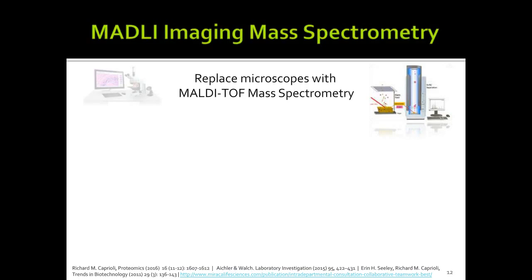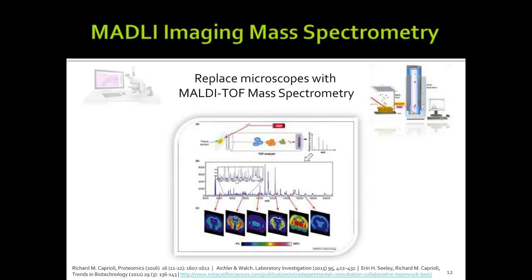This slide just shows a general workflow of imaging mass spec, to show the feasibility of it. People have been doing that, and we are working on it. I think this is a very feasible area for the future for us to give more thought to. On the top is the MALDI process. We have the ionization process, we have the TOF to separate ions, and then we get the spectra at the end.